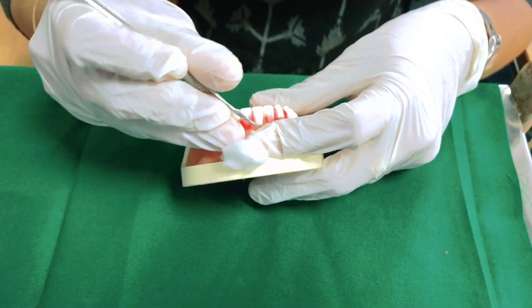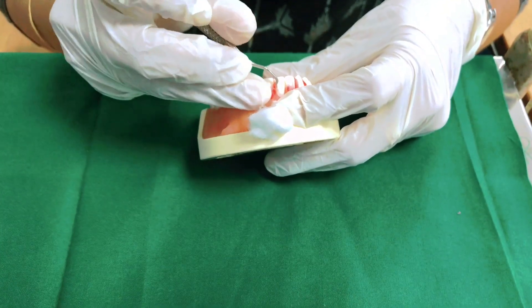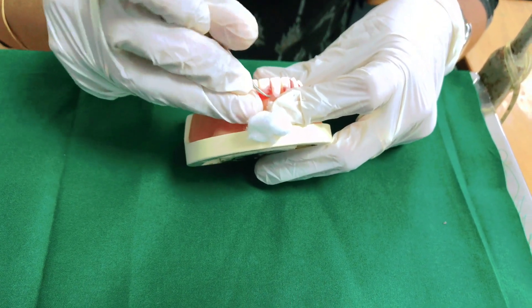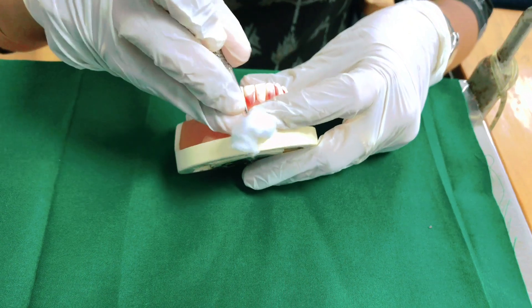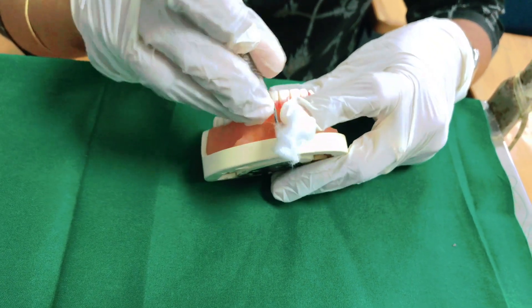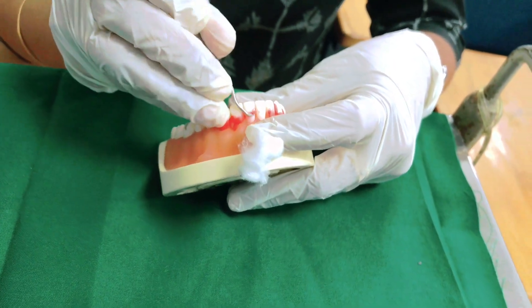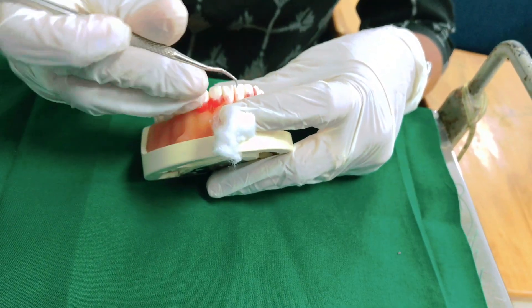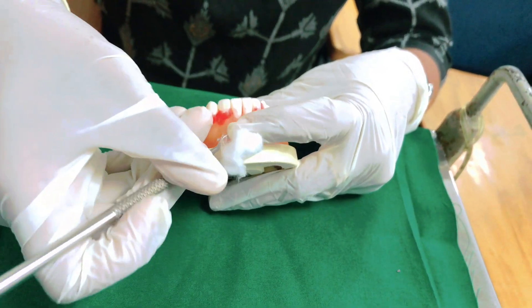This is a wax model, so you won't feel the hardness — it's just to demonstrate how instrumentation can play a vital role. You should keep practicing on your typodont. You should not go below the gingiva at all. Here I am just demonstrating on the two centrals, then repeat it on the other set of teeth.